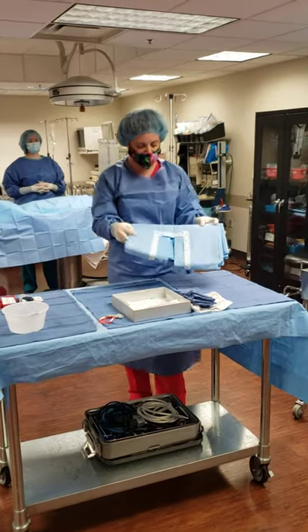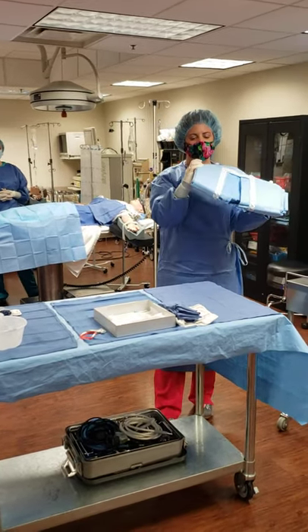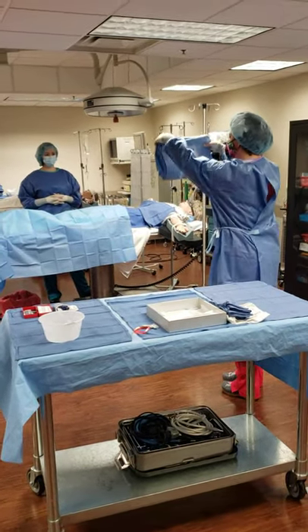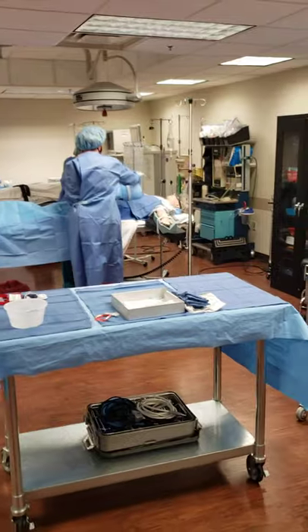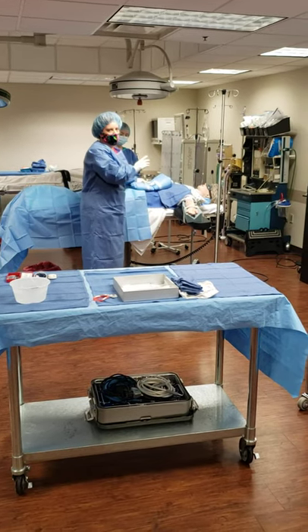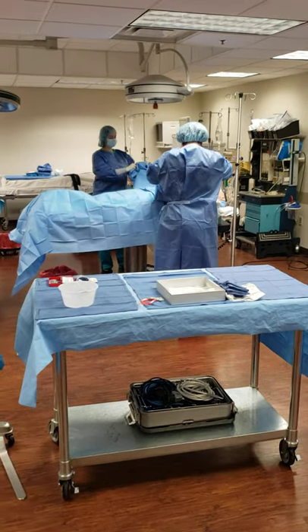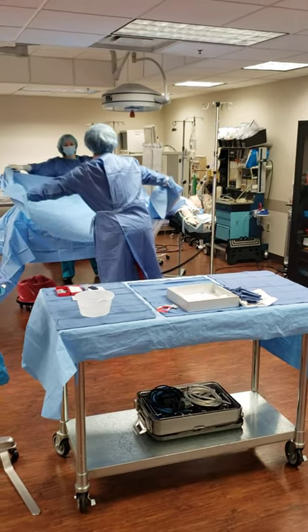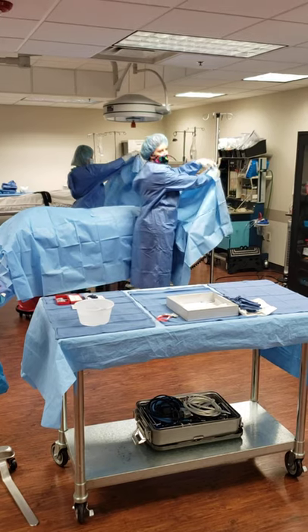You're going to open it up, find the two sides. You're going to give one to your surgeon. Stay up high, come to your side, cuff, and to the feet. Just make sure you don't go down here — you just want to stay in your zone. Here I have what we're going to use as our top sheet — this is a transverse lap sheet. See how it has the guide? There's the guy's head; we're going to orient that towards our patient's head, and center it over that area she left open.